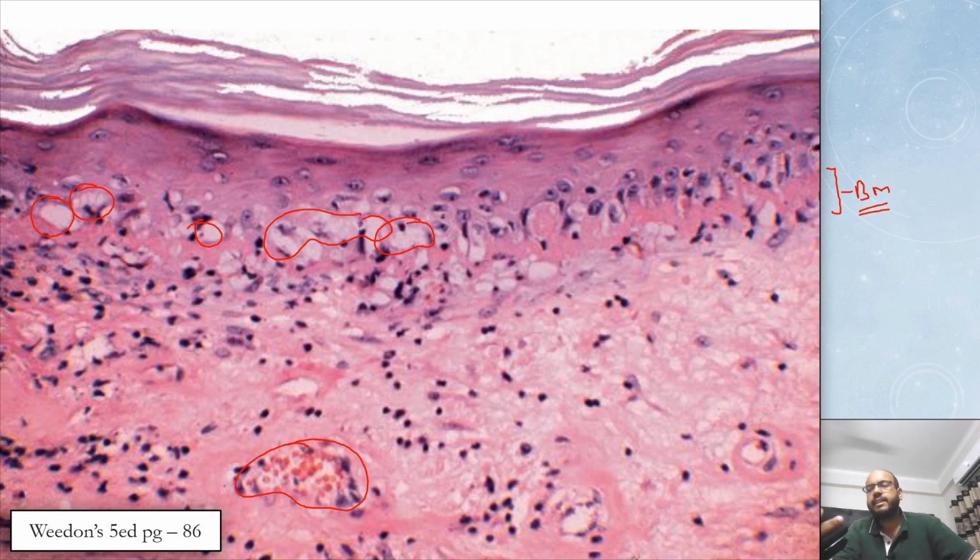So remember that when you're biopsying a lesion from SLE or SCLE, subacute or discoid lupus erythematosus, you have to look at all the features. It's not that you will see a lichenoid tissue reaction pattern with a thickened basement membrane with some amount of focal basal cell vacuolization, and yes, it can be anything from DLE to SLE. No, look at everything. Look at mucin. Look at slight solar elastosis which is present here. But of course, you will be able to differentiate these features when you see a lot of different slides.